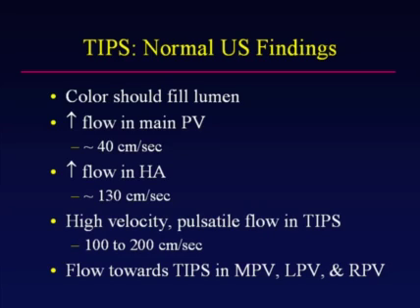Color should fill the lumen of the tips. You should see increased flow in the main portal vein. It increases from about 20 centimeters per second to 40 centimeters per second. There will be increased flow in the hepatic artery, and typically you see high velocity, relatively pulsatile flow in the tips between 100 and 200 centimeters per second.